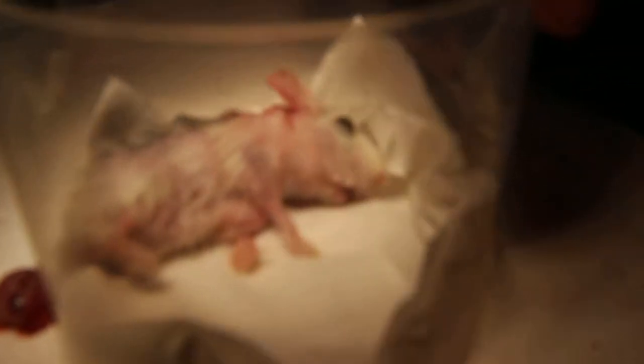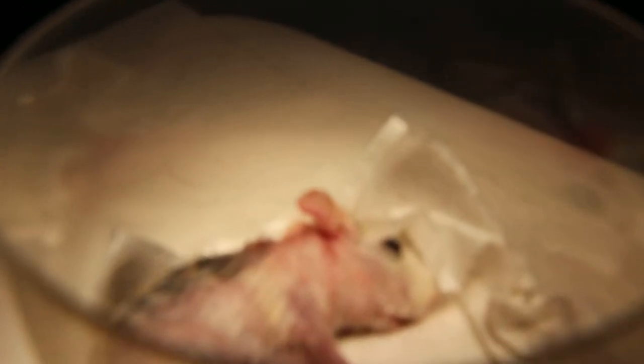Okay. Turn to facing me, that face. Okay, okay. As you can see, the hamster is about to wake up already.